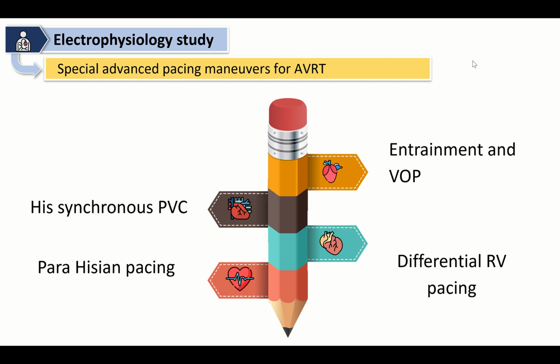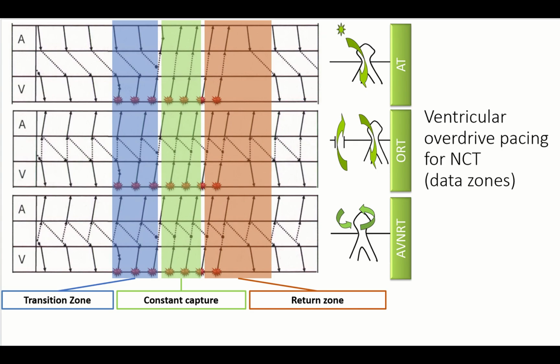Now let's start with the most powerful diagnostic maneuver, the overdrive pacing. It is useful and important, and gives us much data.